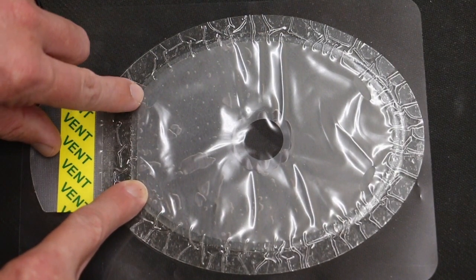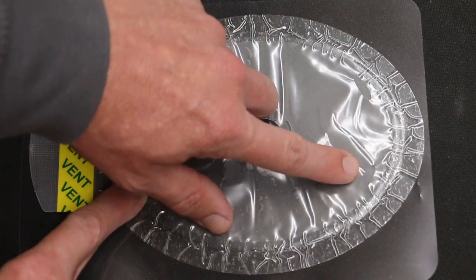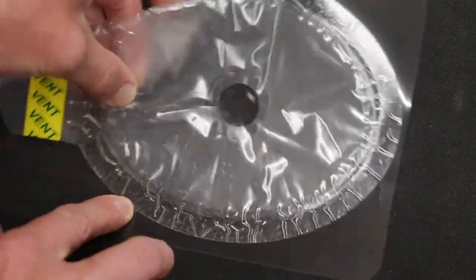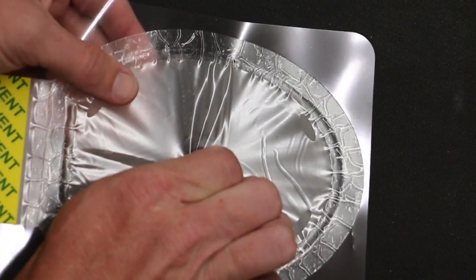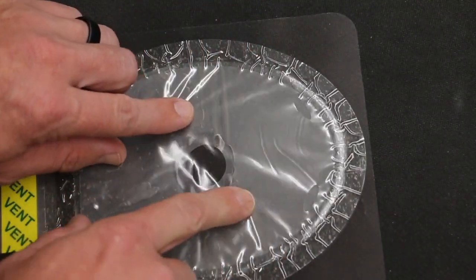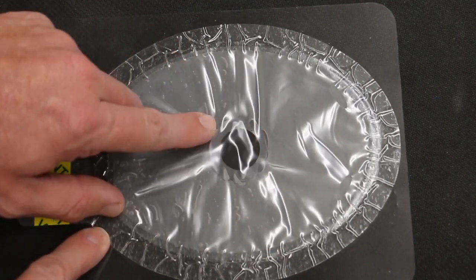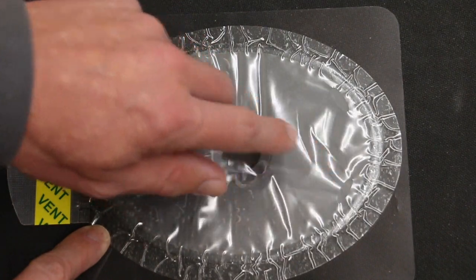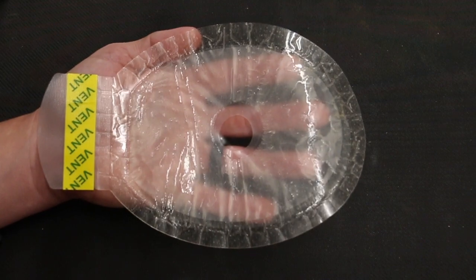There's a hole there. We have a hole here. We have a hole right here. And a hole right here. So blood or air is going to come through the bottom side of the vent, come into this top section here. There's actually 2 pieces of material here. You can kind of move this top layer here. So air is going to come, or blood's going to come up through this hole and then escape out the vents here.